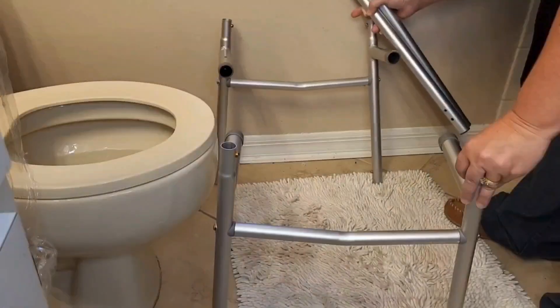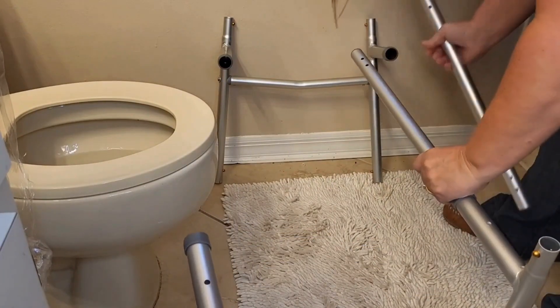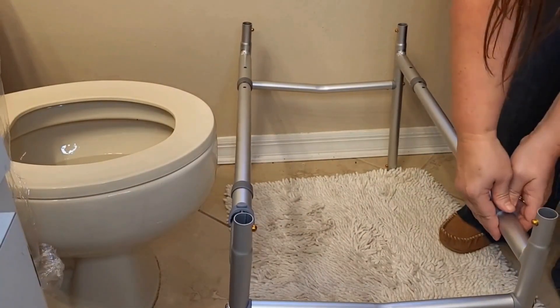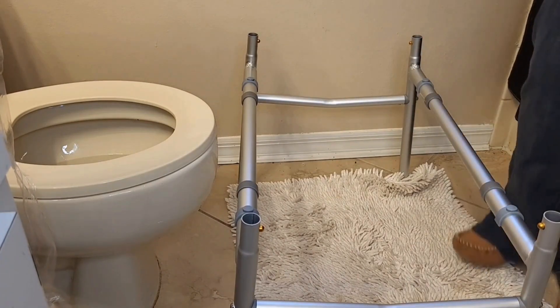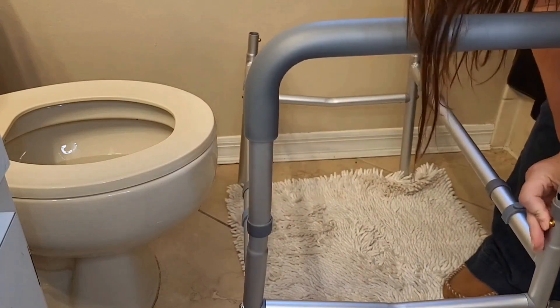Now let's get this all together. It's been very simple to put together — you just slide it in and there are some clips. There are four clips total when putting this together. These V crossbars really offer superior structural support and were very easy to install.